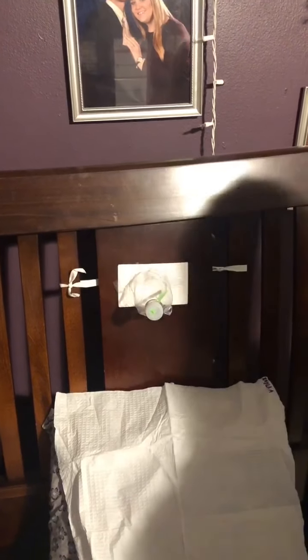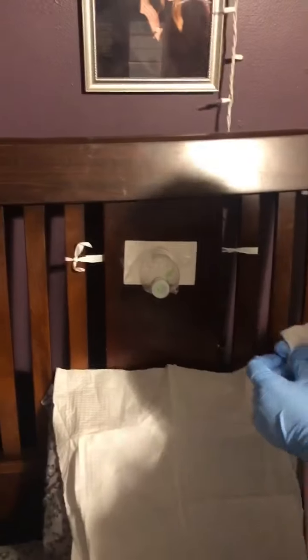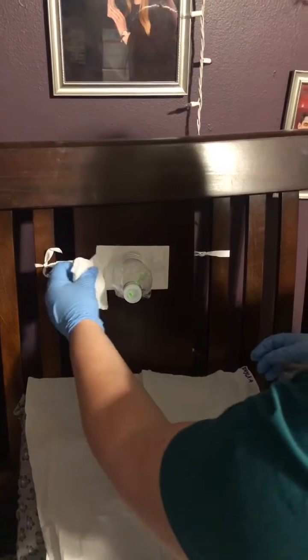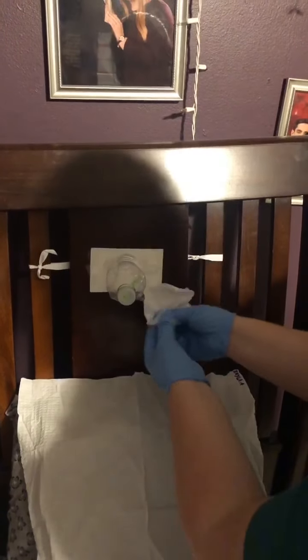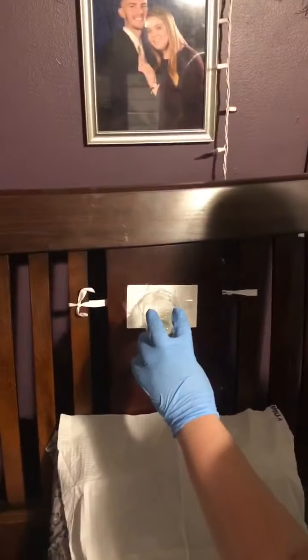Then I'm going to take my dry 4x4 gauze, using a different corner each time, and wipe underneath, just making sure it's dry. So now that's dry, I'm going to give my patient back oxygen.